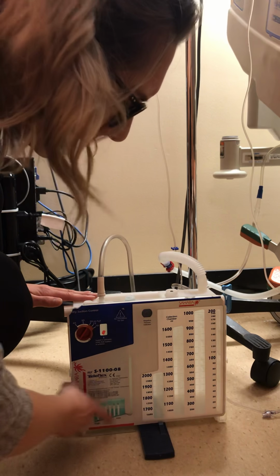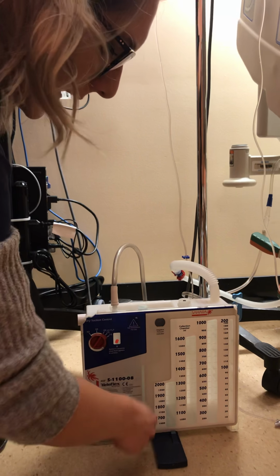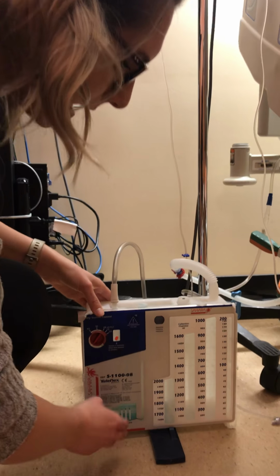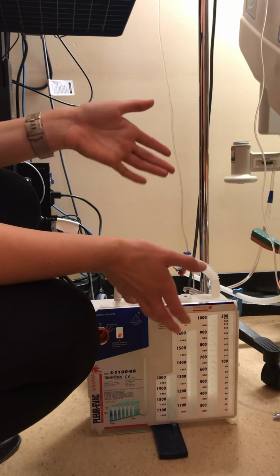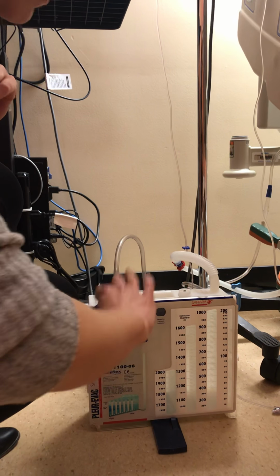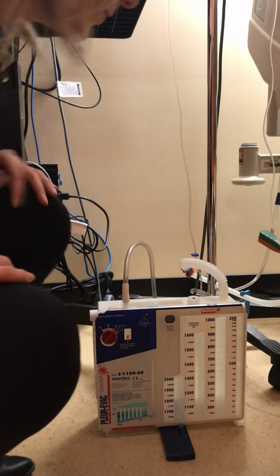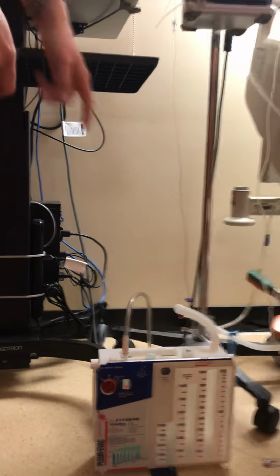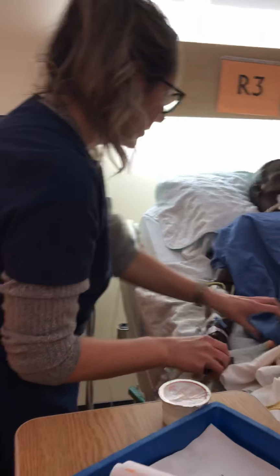In here is the air leak chamber, and I want to see tidaling, oscillating with the patient's breaths. So in here, if I saw jacuzzi bubbles, that would indicate a potential air leak, so I'd want to check that. I may see some champagne bubbles, but continuous jacuzzi bubbles would indicate an air leak. So I'm just going to go up here. I see that there's the right amount of fluid in that chamber.